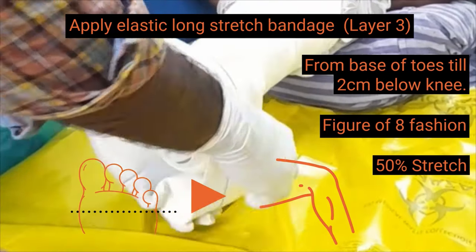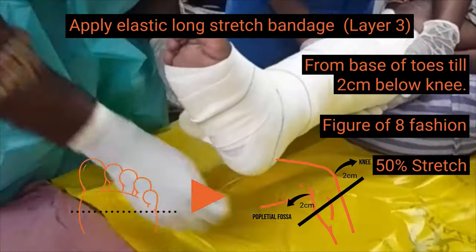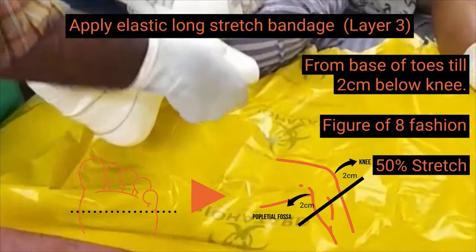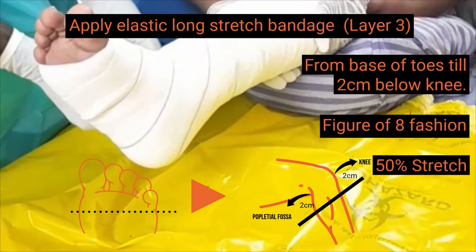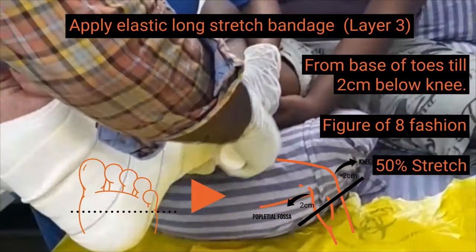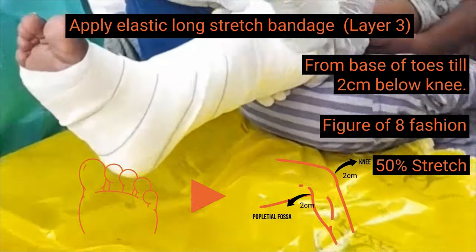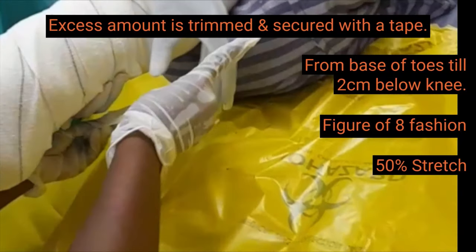Starting point, ending point, and 50% overlap are the same for all four layers. The third layer is secured with micropore, just like the first two layers.